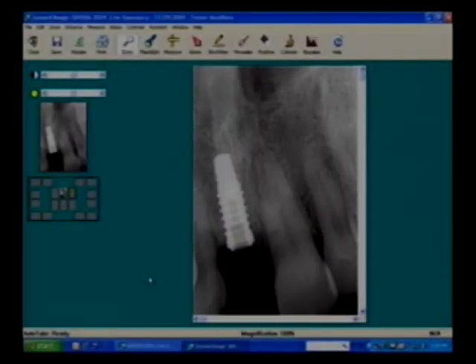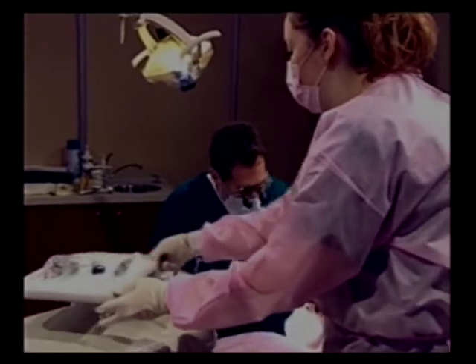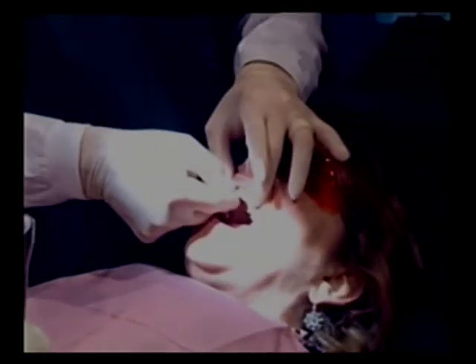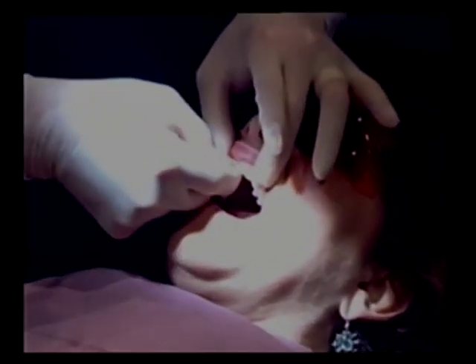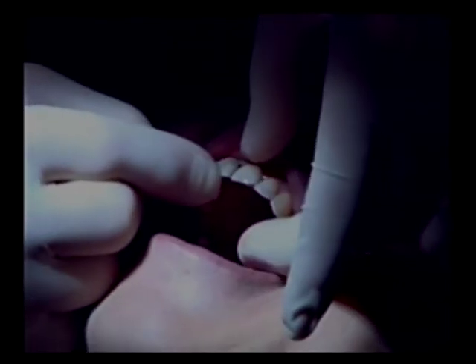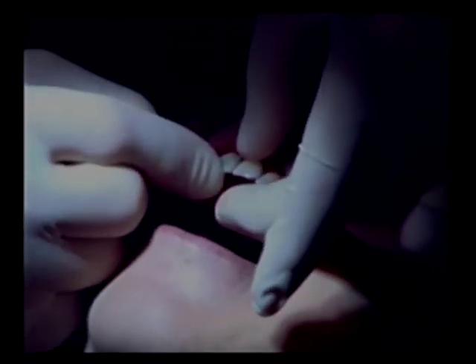It just shows very precise implant placement. I think we're very close to the plan, if not right on. What Carl was telling me earlier is that he would generally leave that a little shy to start with and add to it. But more as an exercise of precision, he went to the full contour today.